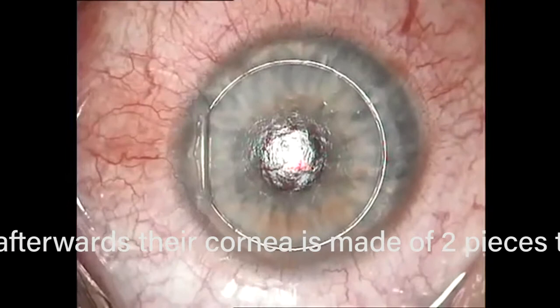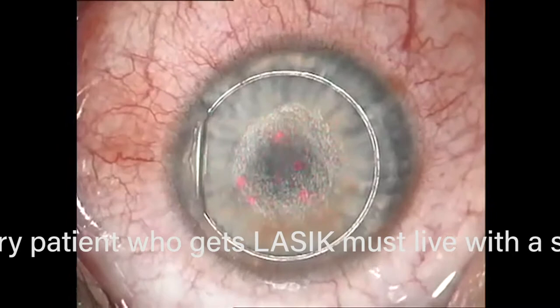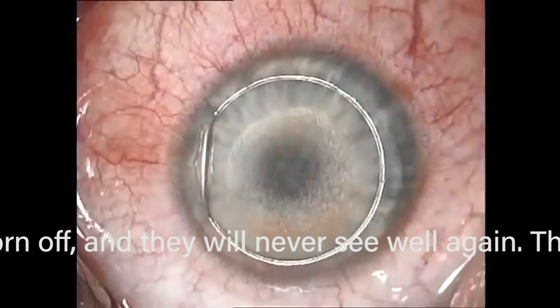Now this is the laser going off — we're just removing some cornea to eliminate the prescription. You could also have the flap rolled up or wrinkled. A big problem is epithelial ingrowth: the skin of the eye can go underneath the flap instead of just healing on the edges. You have to lift up the flap again and scrape off the epithelium. If it's too persistent, sometimes you have to sew the edges shut to prevent epithelium from growing in, which can cause induced astigmatism.